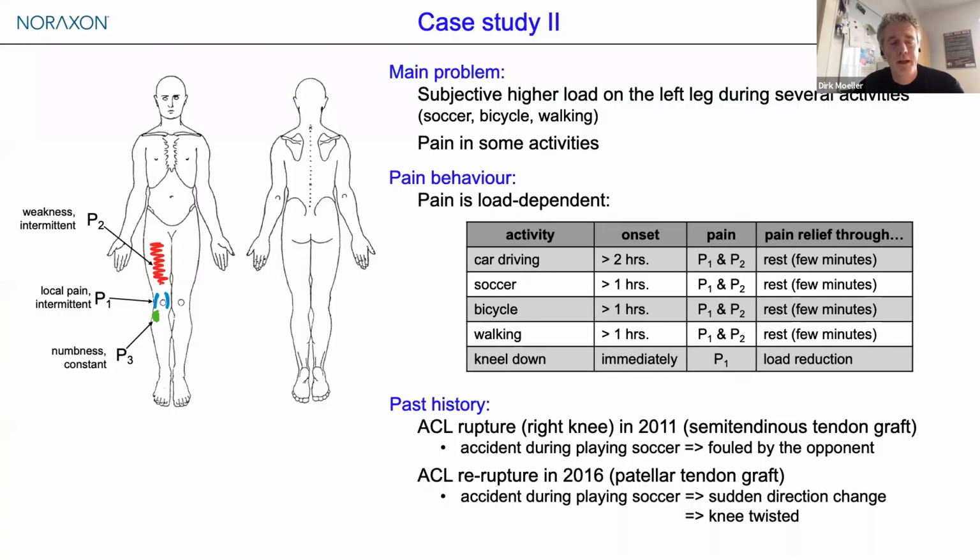And I'm absolutely happy about this case because this is not my case. I'm very proud of it because this is a case of one of my students. In this case, my student shared this in her defense of bachelor thesis, I think 2 weeks ago. So it's fresh data. She was a bachelor student of mine. She was a physiotherapist, but she was not experienced to work with the biomechanical stuff and was not experienced to work with the EMG. Her thesis was about implementing an EMG into the normal clinical reasoning process on a real patient.